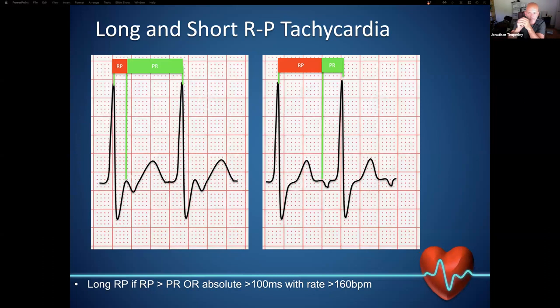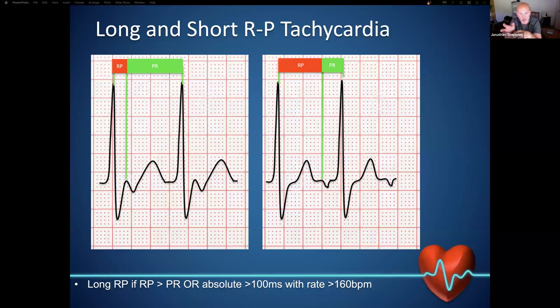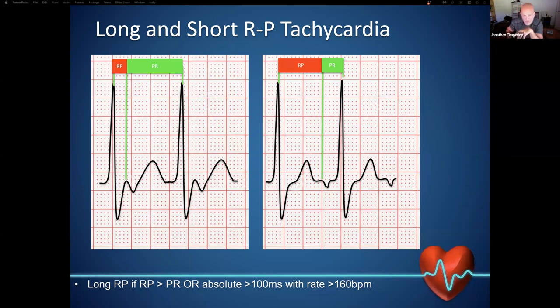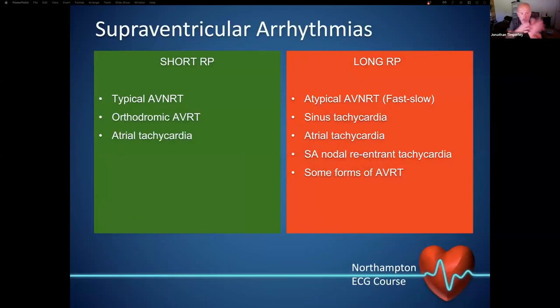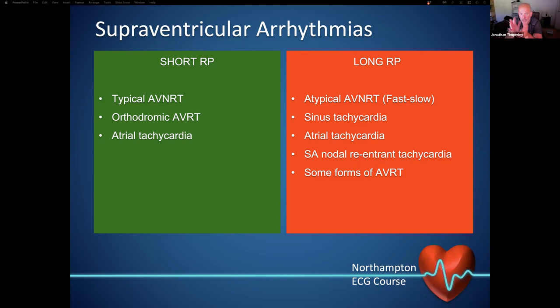We can also classify supraventricular tachycardias in terms of their RP relationship — long RP and short RP tachycardia. That's determined by looking at your QRS and measuring back to your P wave: is it short or long? From there we classify into short RP tachycardias — typical AVNRT, orthodromic AVRT, and atrial tachycardia — and long RP tachycardias, which include atypical AVNRT with a fast-slow pathway, sinus tachycardia, atrial tachycardia, sinoatrial node re-entrant tachycardia, and some rare forms of AVRT.